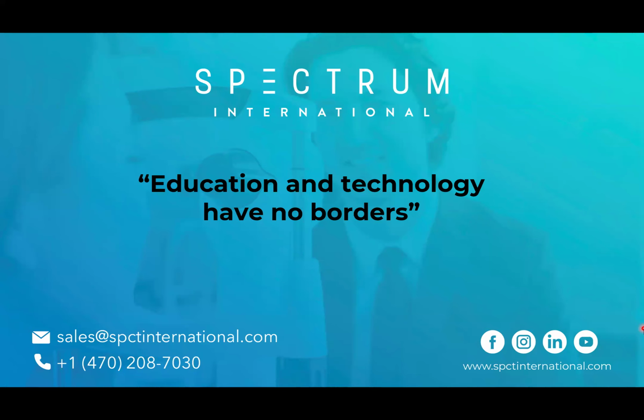Me puso algo más Fabio, ya que Fabio me contestó, el famoso ORA, sí, se me fue de momento, el Ocular Response Analyzer. Es la máquina que se usa para medir histéresis corneal. Interesante. Gracias por la pregunta, Fabio. Excelente pregunta.